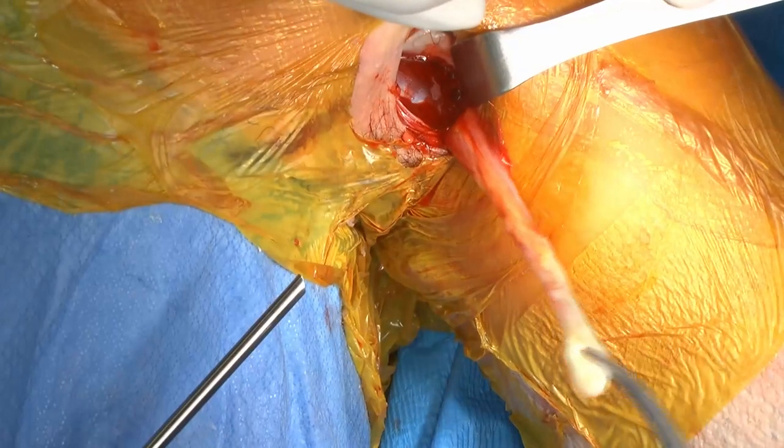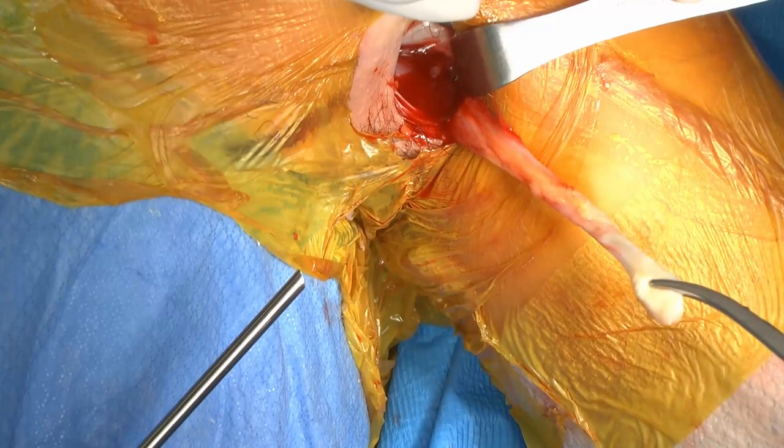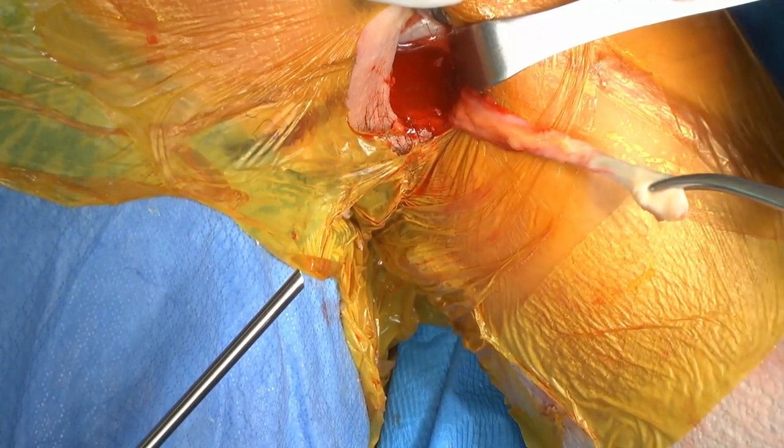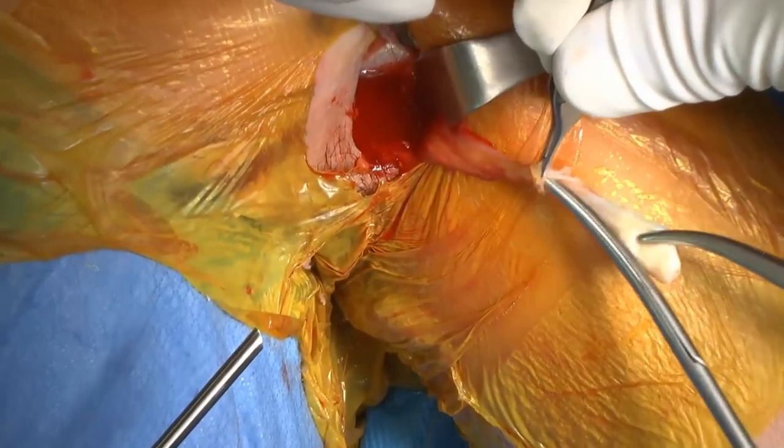So we're going to take this out to let that relax. And then we're going to just trim up the biceps. So hold this for a second. And then we'll just trim off some of this inflammation you see right here.